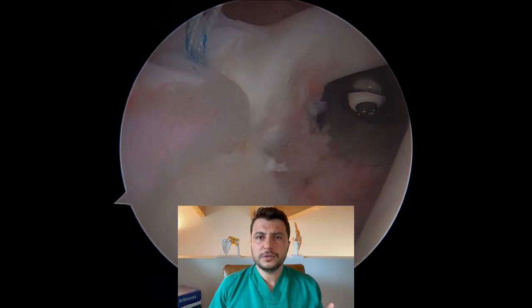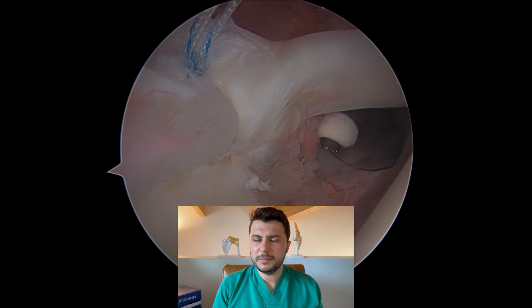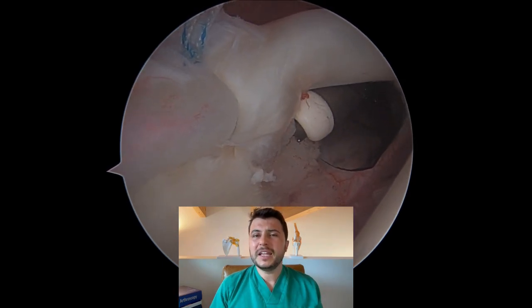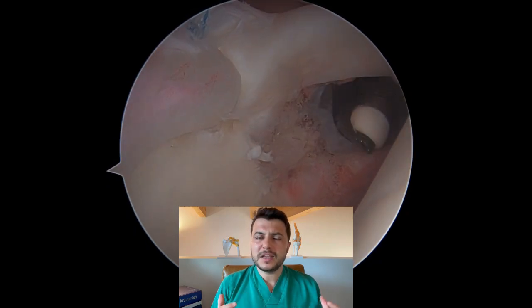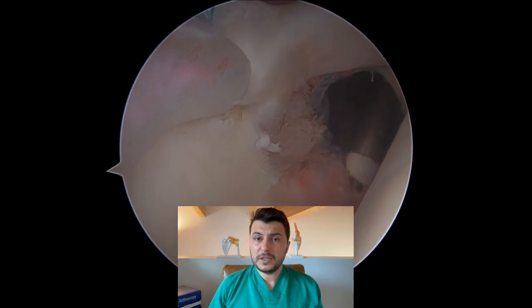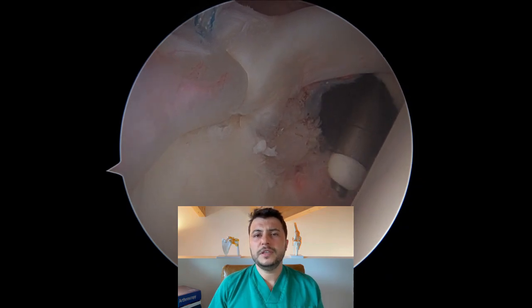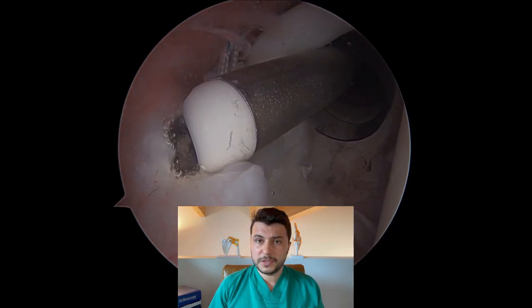We finally introduce our radiofrequency tool one last time in order to regularize and cauterize the residual fibers of the tear, as well as to perform radiofrequency coagulation of a hyperemic synovial membrane that we often see in chronic inflammatory disease, such as in throwing athletes with a chronic SLAP tear.